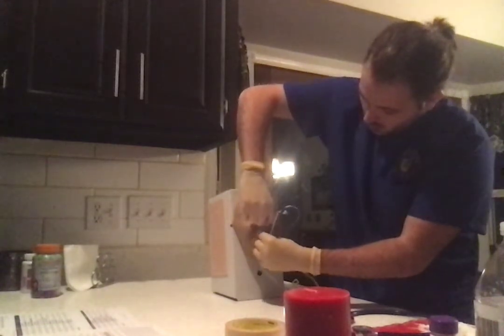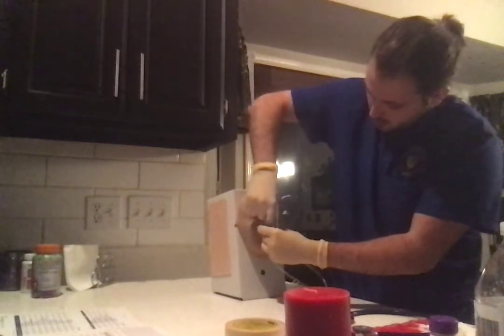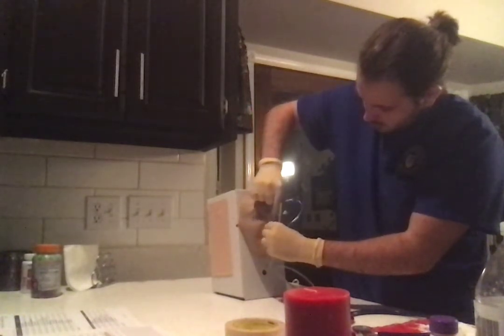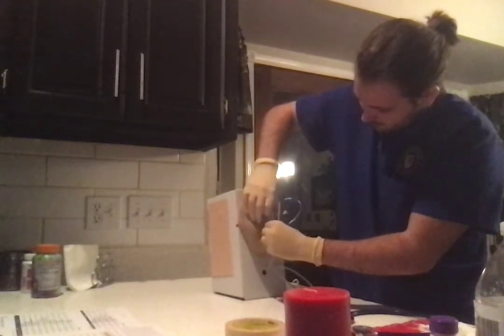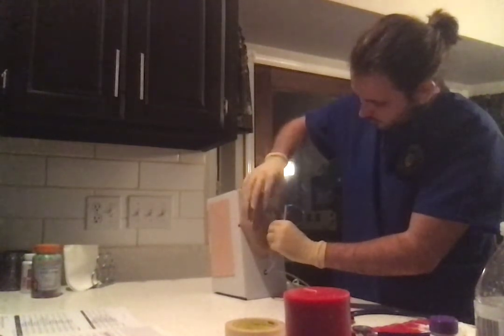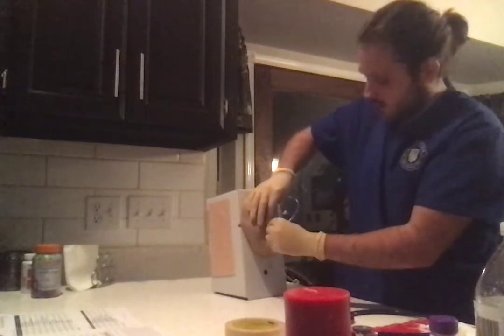we would anchor the tube to the nose with one piece that we've torn.